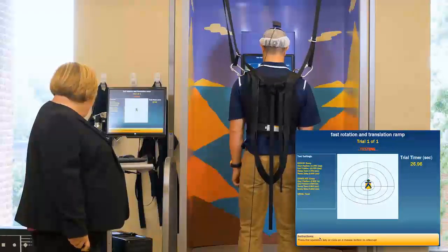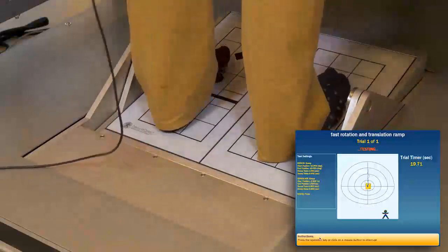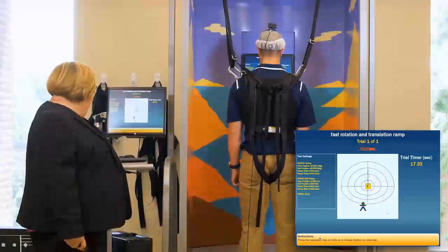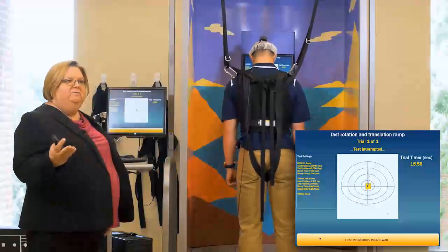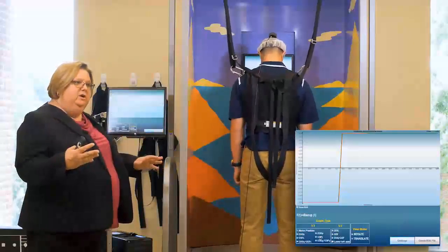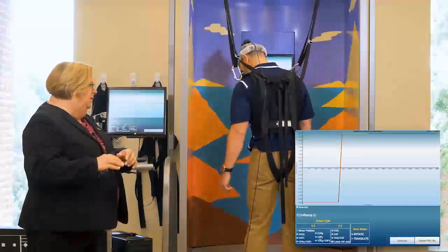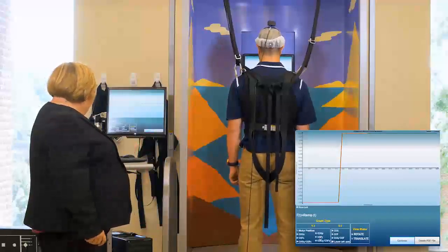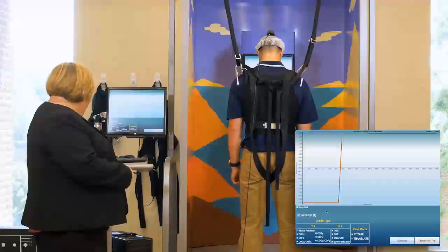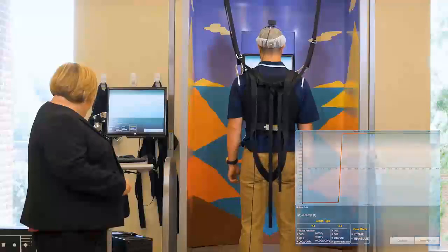Again, there's a delay of about 8 seconds. And it actually made him step. Okay. And I'm going to stop it because he did step off, and for safety's sake, I want to make sure he's not where it moves, the corners where it's moving when I reset it. Okay, so he stepped back on. But you can see how abrupt that ramp rotation was.